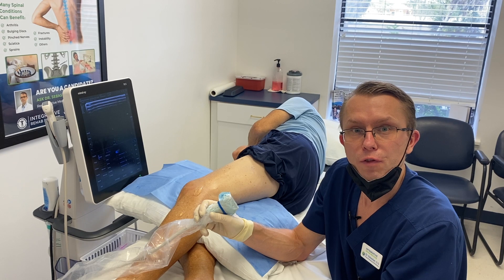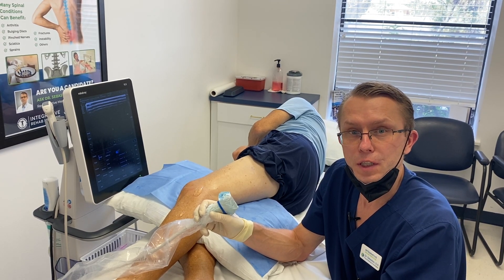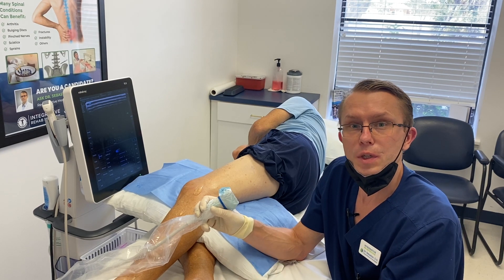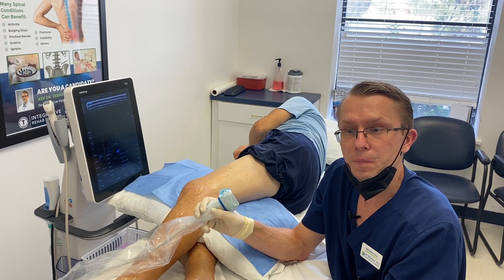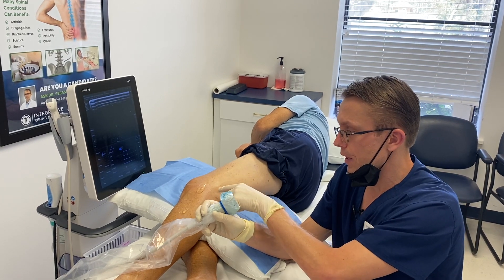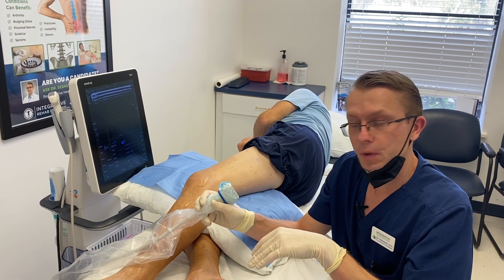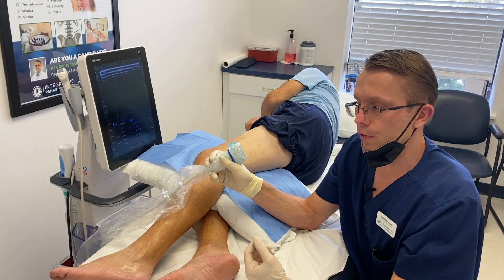Today I'm going to show you how I treat fibular neuropathy. This patient has neuropathy in his feet and his legs, causing some numbness and some pain. We're going to treat the fibular nerve, which runs down on the side of the leg and controls the foot — allowing the foot to move up and down and giving sensation to the top of the foot.